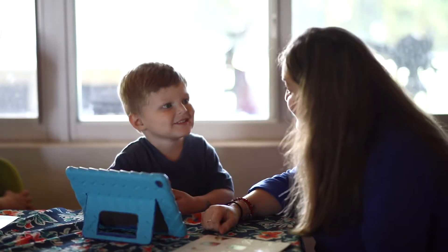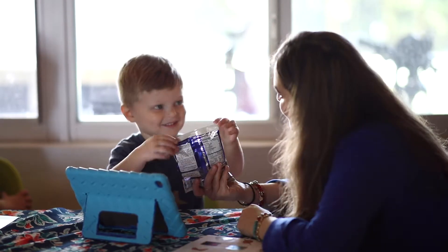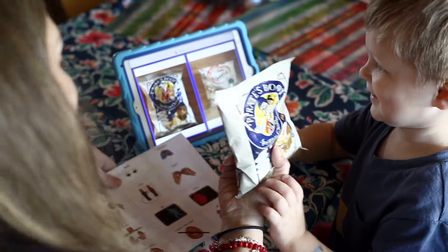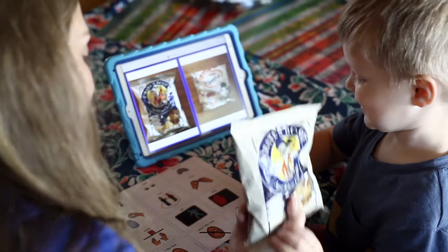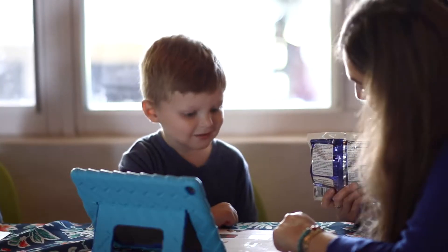Dylan chooses and his mom responds enthusiastically. She then prompts the next interaction: "What can we do now? You gotta show me. What do you want to do now?" Dylan responds: "Open!"